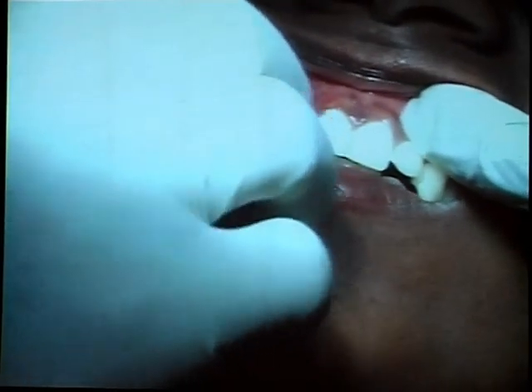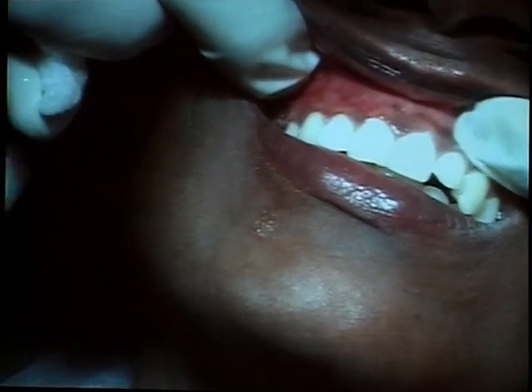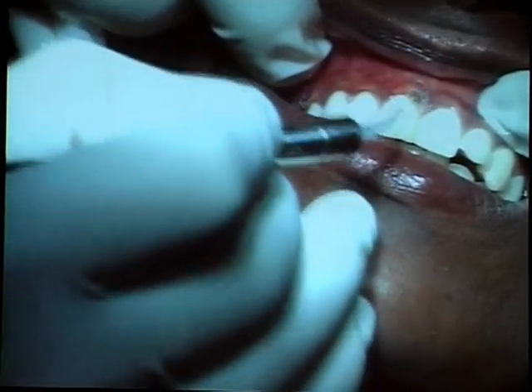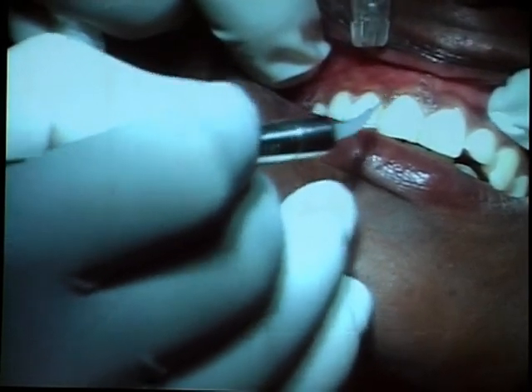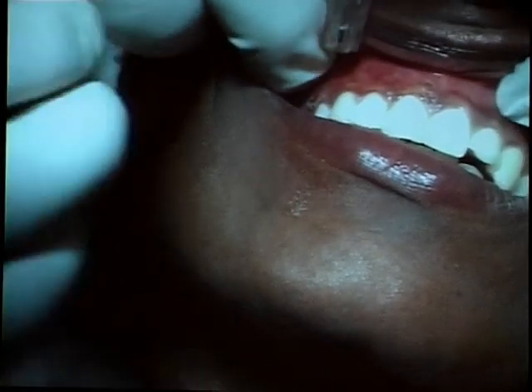So in the interdental papilla, you may have to go two times. You have to call the patient back after about one week or 10 days and do it again. Then, in about 6 months, you can expect the patient to come back. So you have to tell them this is a cosmetic procedure. To different people, the pigment comes back differently. So it's not a forever thing. I just wanted to make a comment on that.